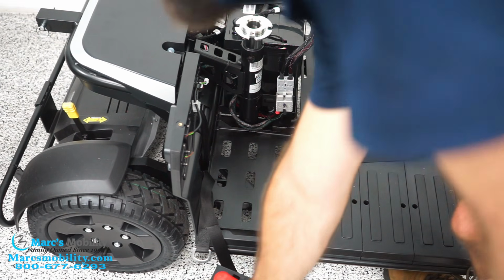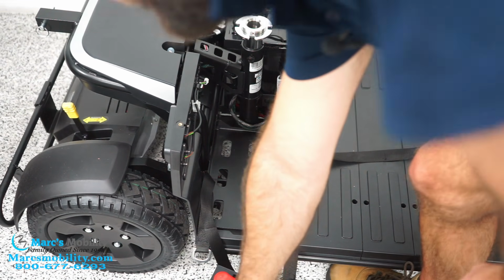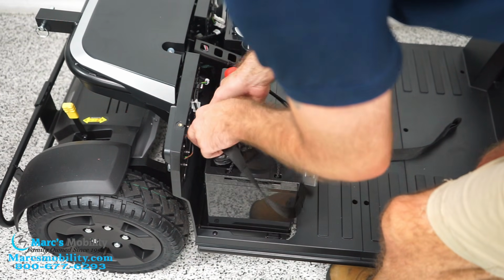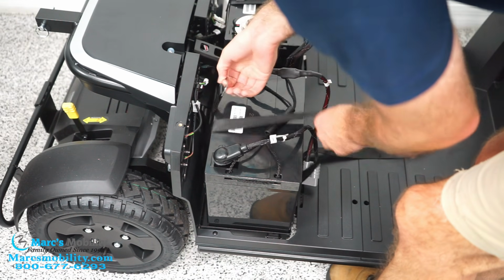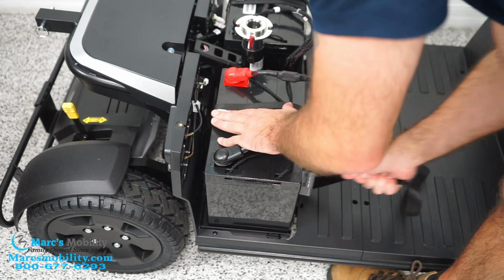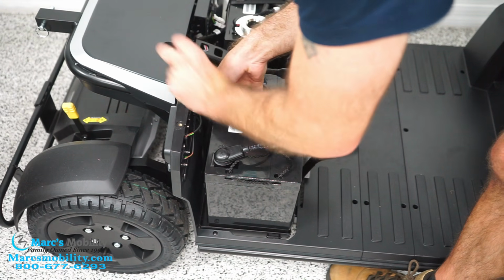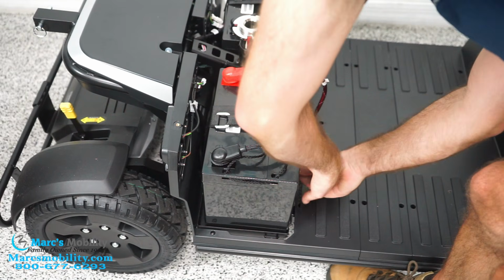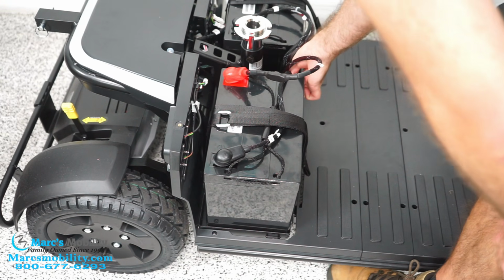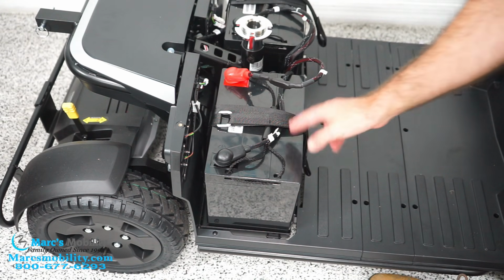Now we're going to load the battery back in. We're going to make sure these straps are on the outside like this. None of them run underneath the battery. We're going to drop the battery in, making sure they're out of the way. Bring the strap over. You want this sitting right about here. You can see the other one as an example. And we'll pull this end tight through here. Then it snaps down at the base. From there, we're just going to plug our plug back in. There we go. Remember, we're going to do both batteries. I showed you one, but we're going to do both.